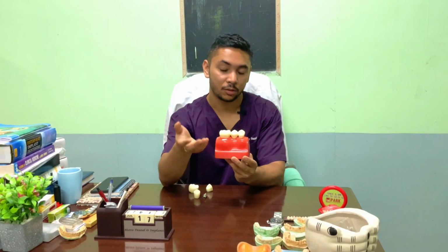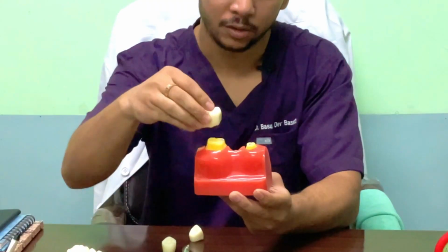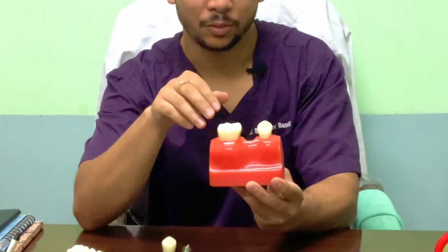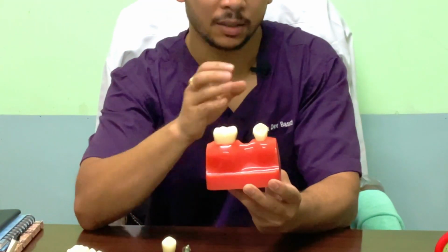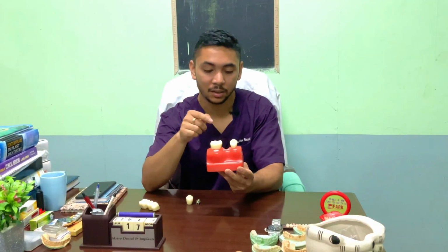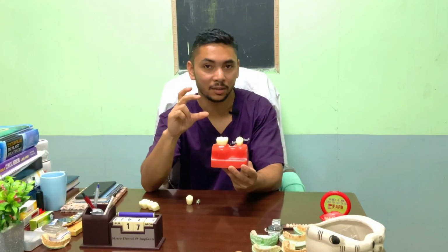Now let's talk about the other technique, that is dental implants. In dental implants, the two healthy teeth will remain as they are, we will not even be touching these teeth. So there is no harm produced to the natural teeth, and only in this region where there is a missing tooth, a dental implant is placed in the bone.